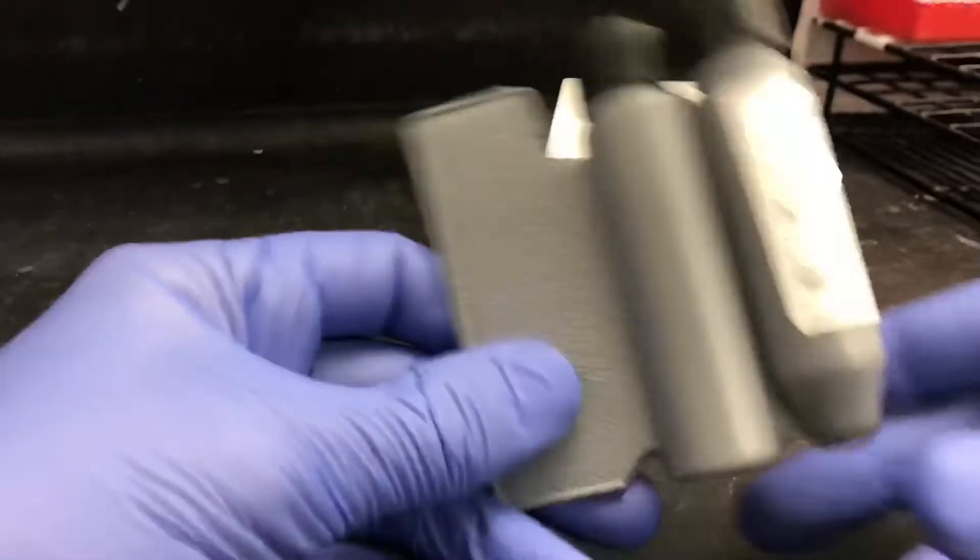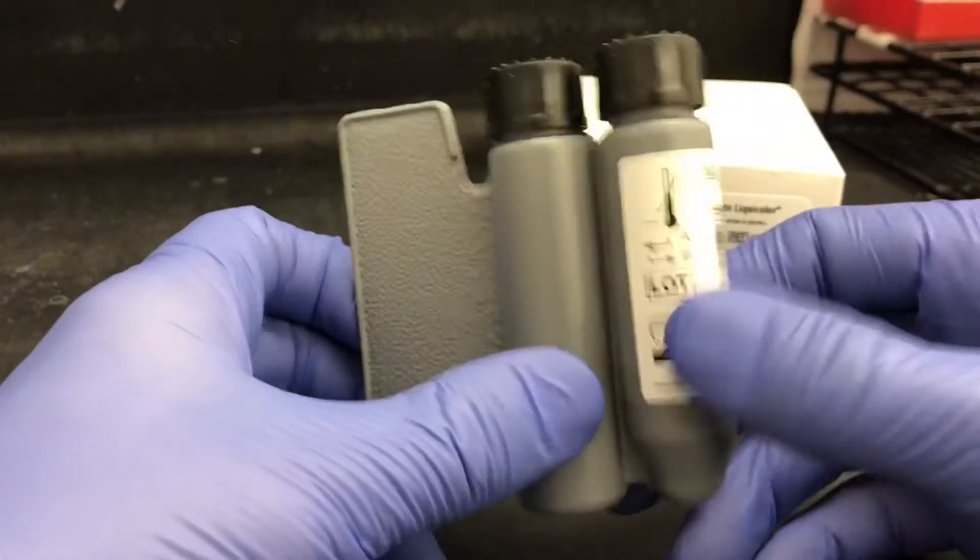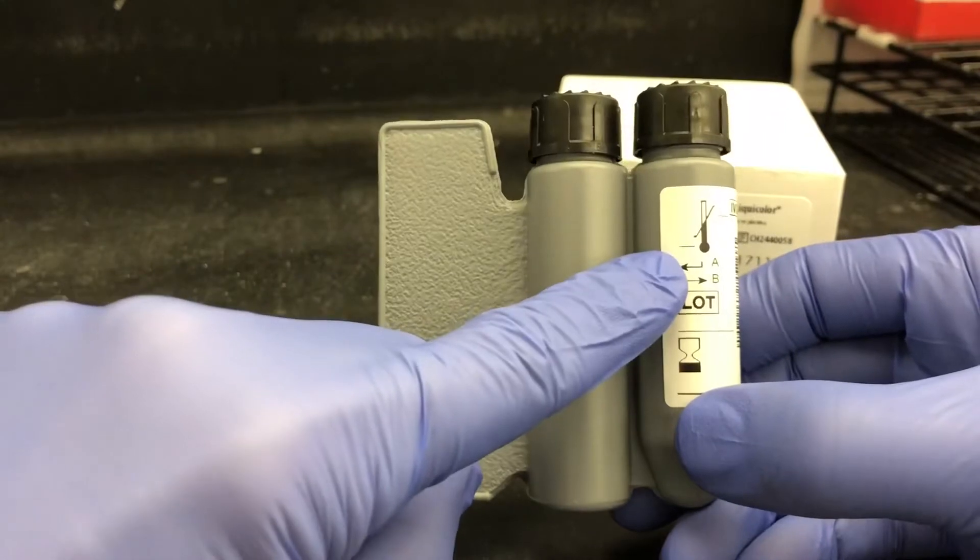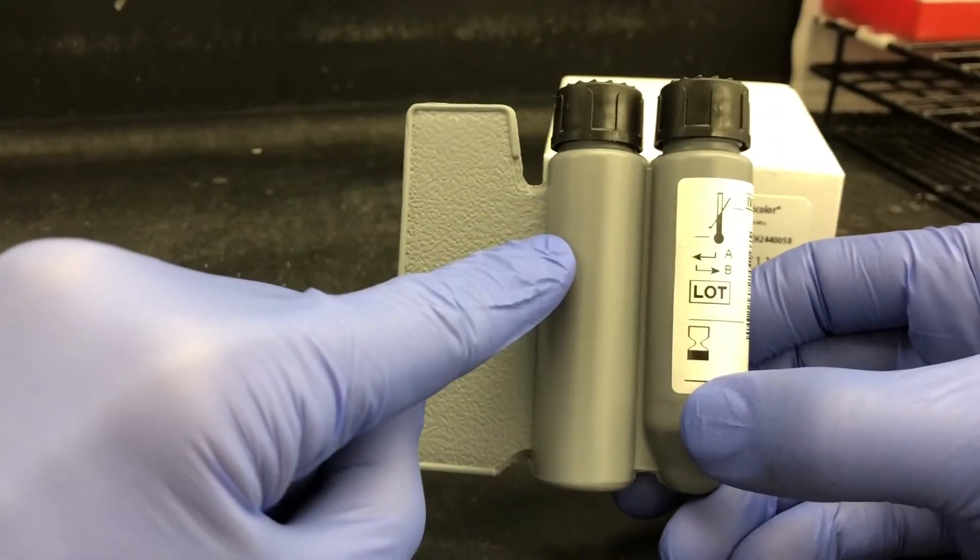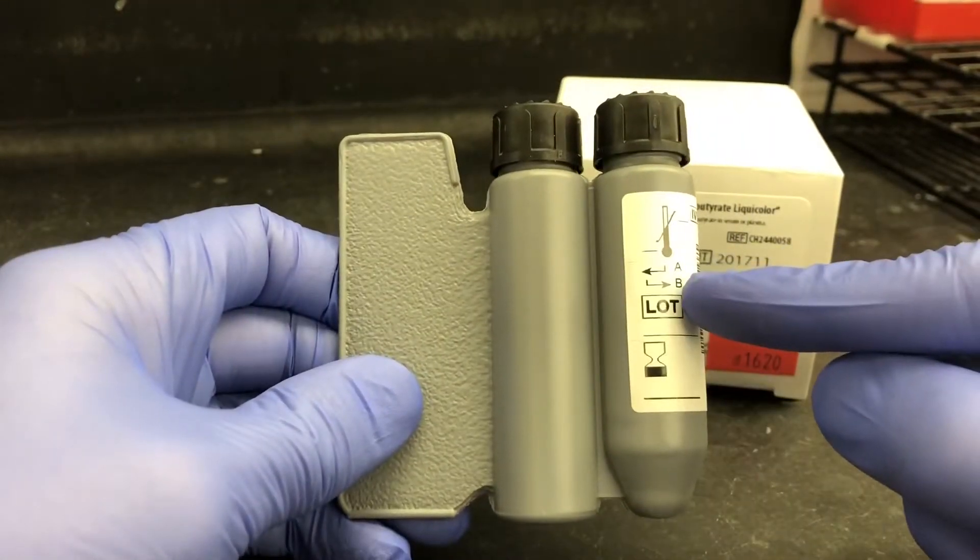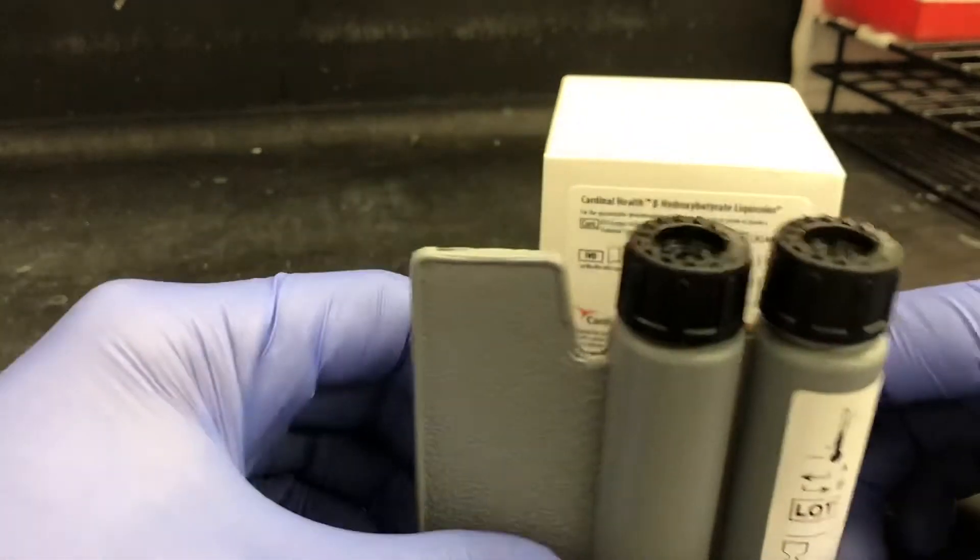This is what the user-defined reagent packs look like. They are marked A and B side, as you can see there, A side being for R1 reagents and the B side being for R2 reagents.